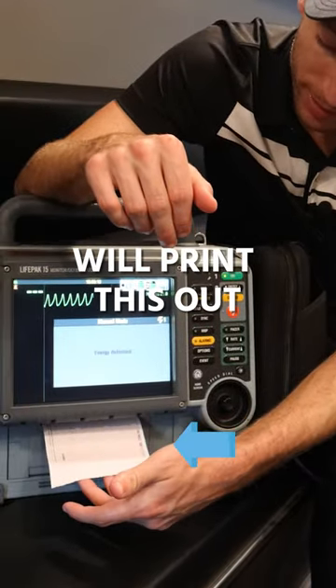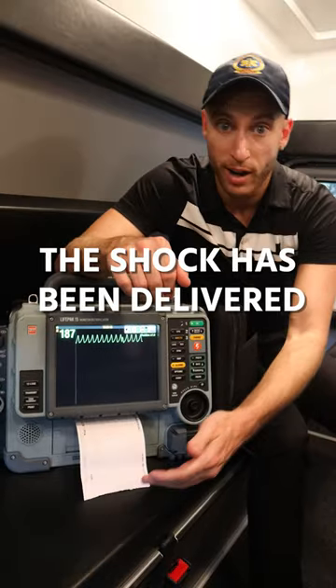The actual LifePak will then print this out and show you the shock has been delivered. Follow my page here — I go over all of it.